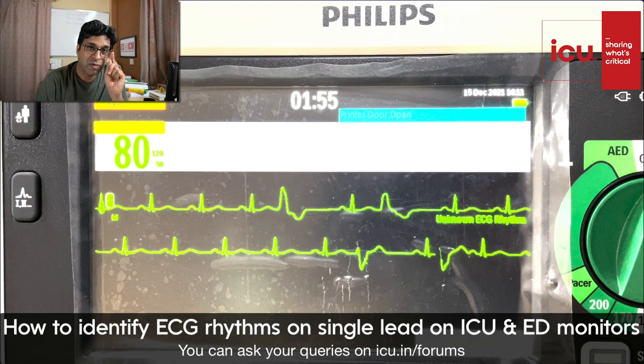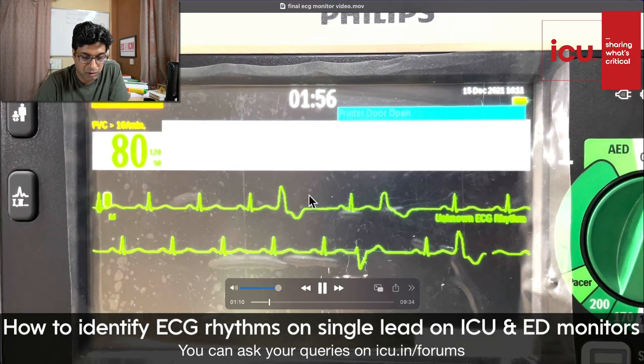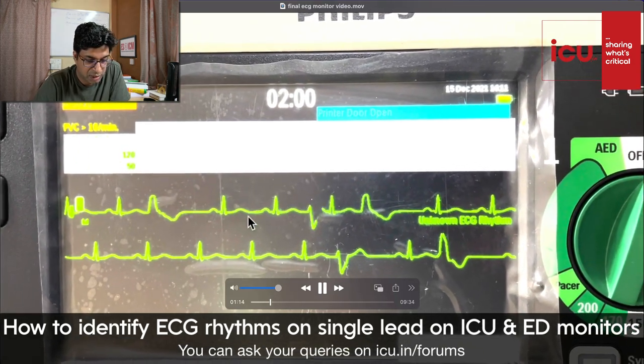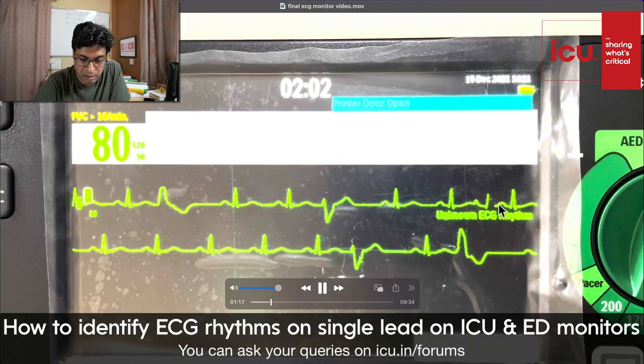And if they are coming with uniform morphology, then it will be unifocal. If they are coming in pairs, that will be a couplet or bigeminy. And if they are coming in different morphologies, meaning they are originating from different portions of the ventricle, then there will be multifocal PVCs. Okay, so these are multifocal PVCs. This is different.